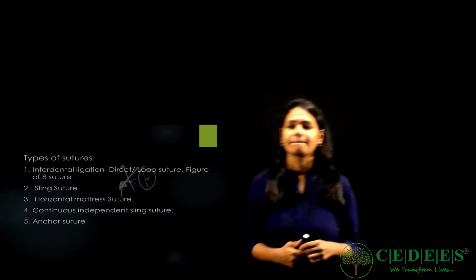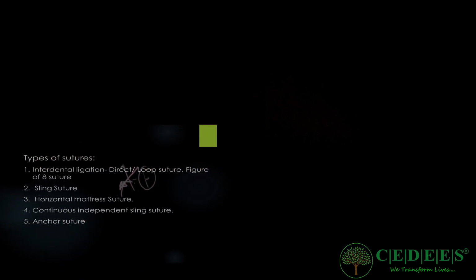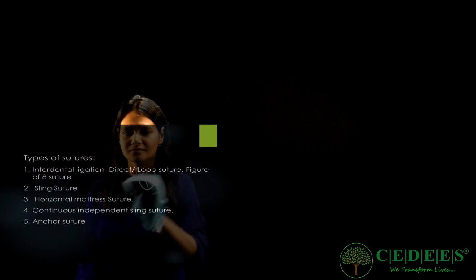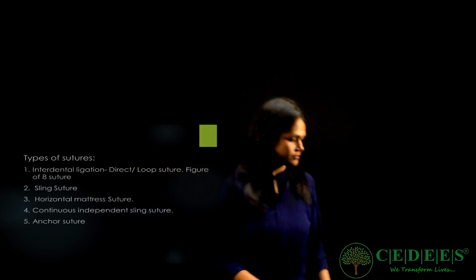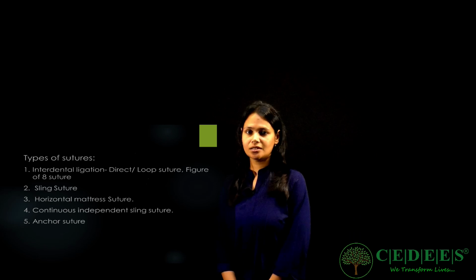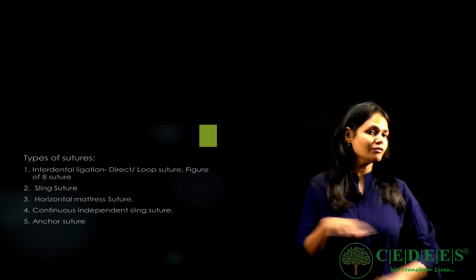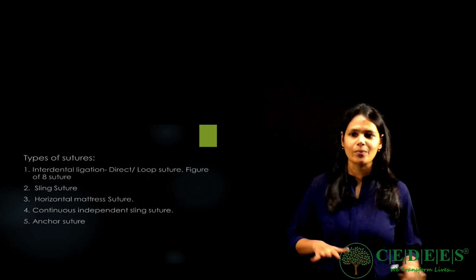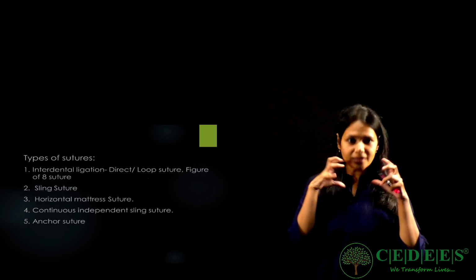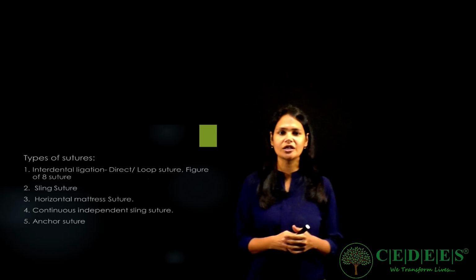Now coming to sutures. Just quickly, I'll tell you in exam how to identify the suture. Now they give like 3-4 images and everything looks the same. So today I'll be covering 4 or 5 major types of sutures, and once you understand those basics, how to identify a suture, then you can identify definitely any other variation that they give.